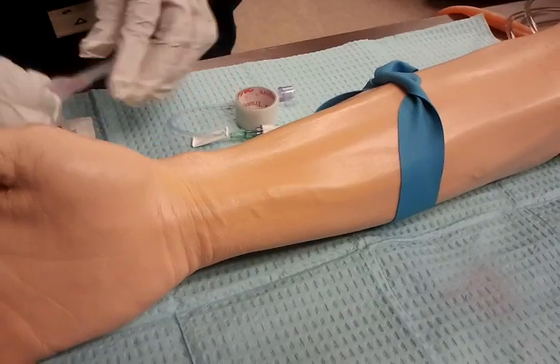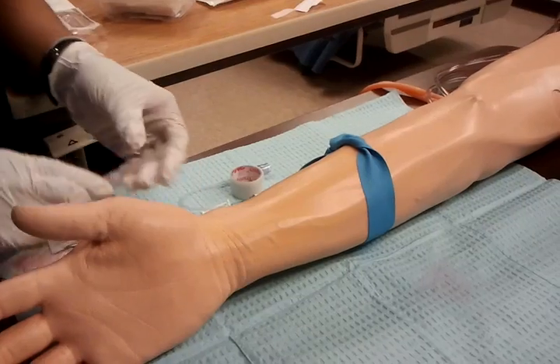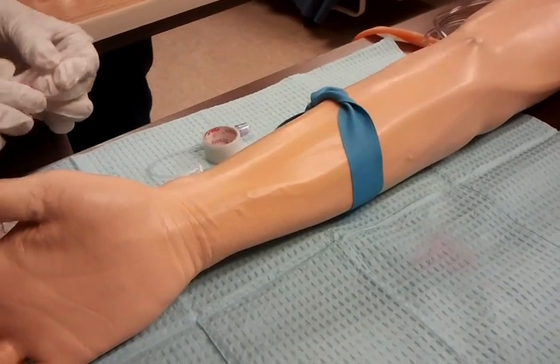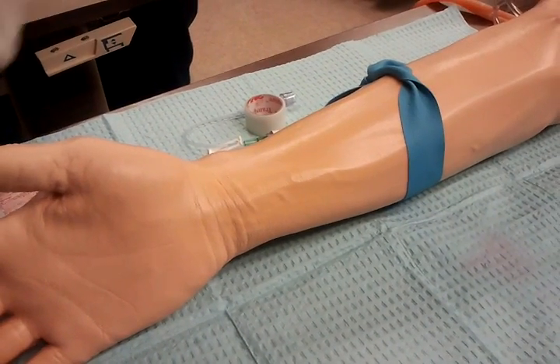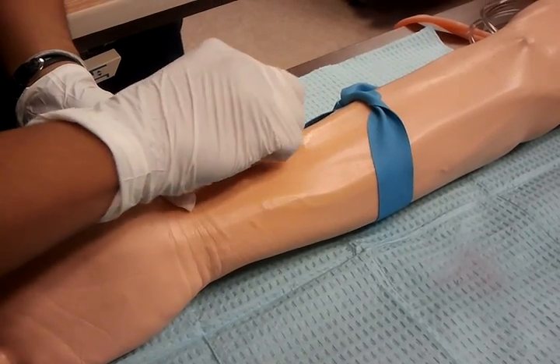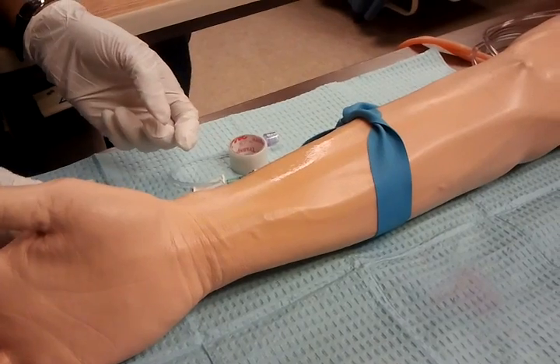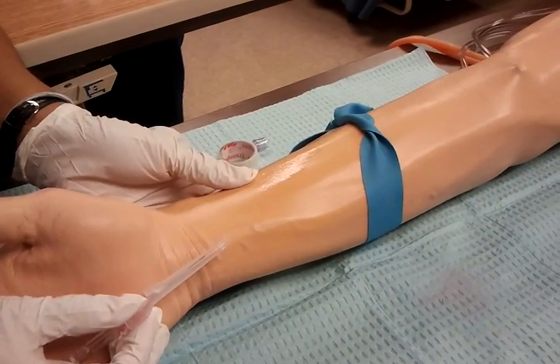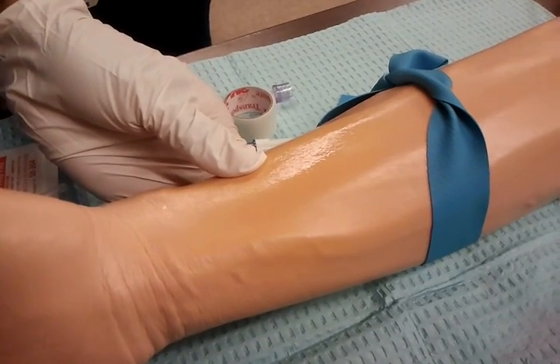Once you found the vein, you can release the tourniquet temporarily. Tie tourniquet safely. Cleanse the insertion site. Stabilize vein by pulling skin taut in opposite direction of the venipuncture. Explain the client will feel a quick, sharp stick.